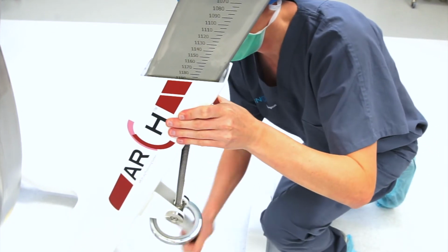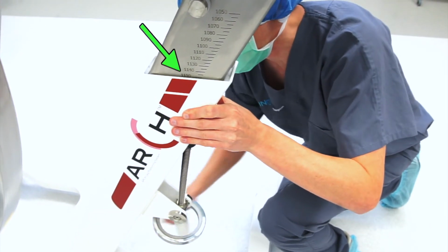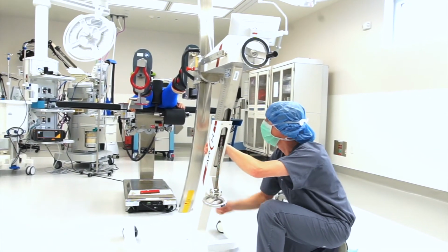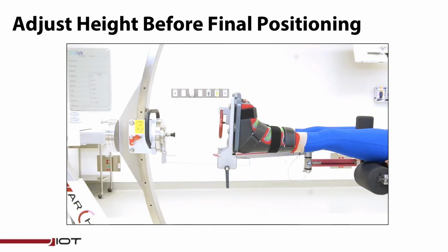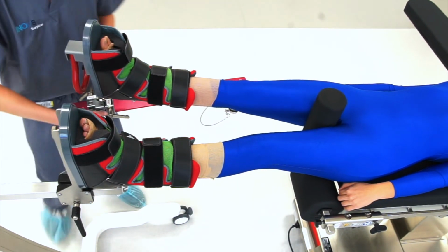After both boots are attached, adjust arch height. The height setting is shown here in millimeters. Use the height adjustment hand wheel to match the height of the operative and non-operative boots. It is important to adjust height before final positioning of the arch, as the angled design of the height adjustment mechanism causes the C-arch to move more distal when raising the height and causes the C-arch to move more proximal when lowering the height. Make any necessary adjustments on the OLH.